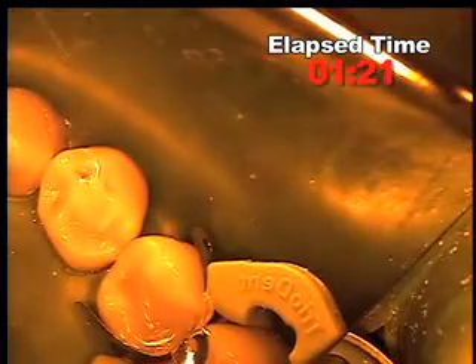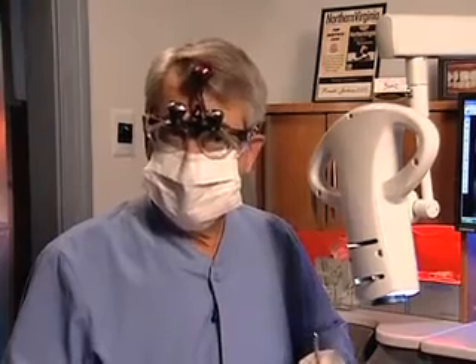Now we'll cure the sonic fill using the LED Demi for just 10 seconds. Because of the depth of cure of sonic fill and the fact that the cavity was less than five millimeters deep, we only need 10 seconds from the occlusal. We'll augment that once we remove the matrix band.